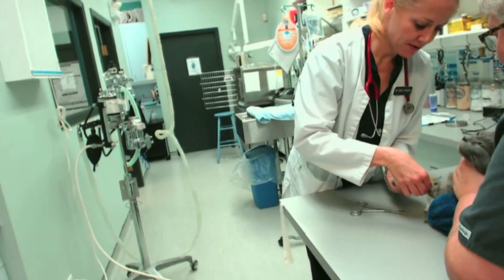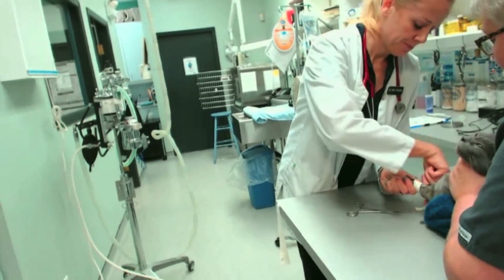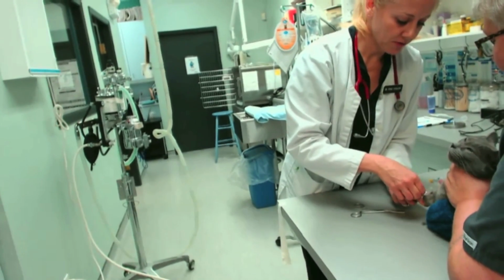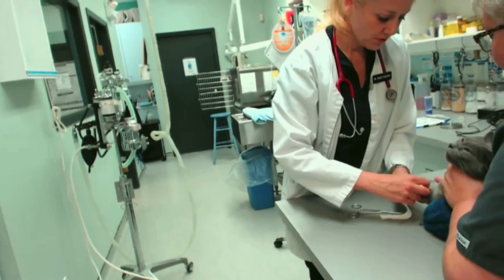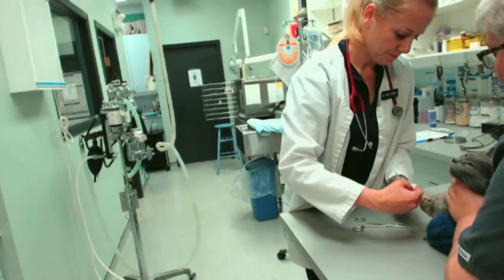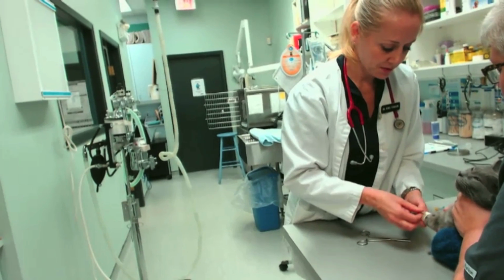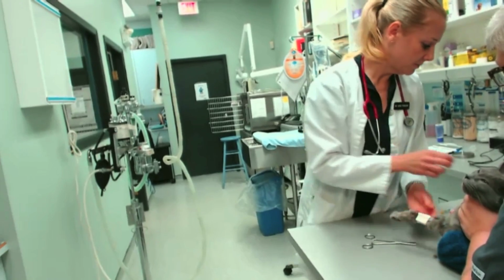So we are just taping in this catheter so that when she moves it doesn't come out. Because she's still very much awake, she's just a little bit sedate. With the pre-medication that you give beforehand, it allows you to use less anesthetic drugs, which is safer for the patient. You don't have to have them on as much gas. It's safer to use a smaller amount of many medications than a big dose of one, because all medications have side effects. So you avoid the side effects if you have a nice combination of smaller amounts of medication.